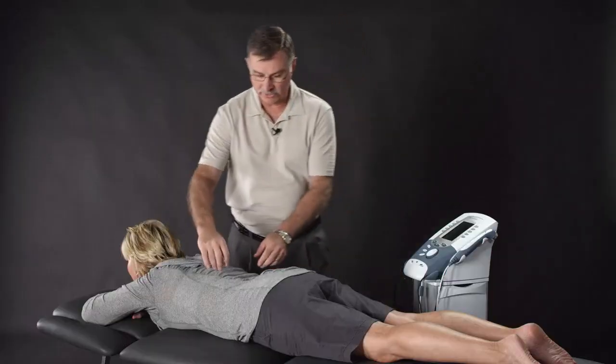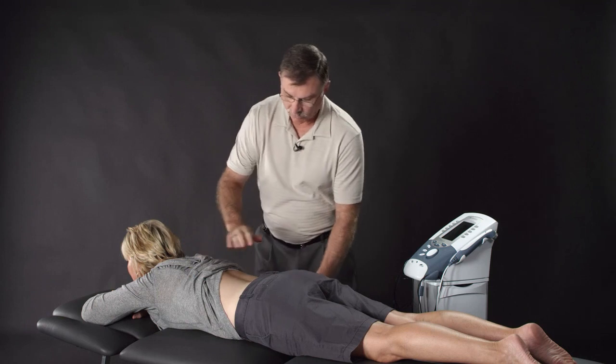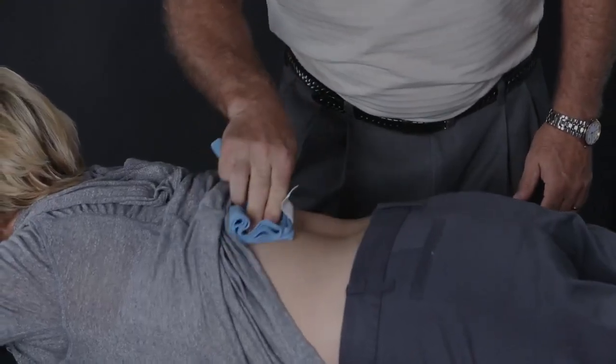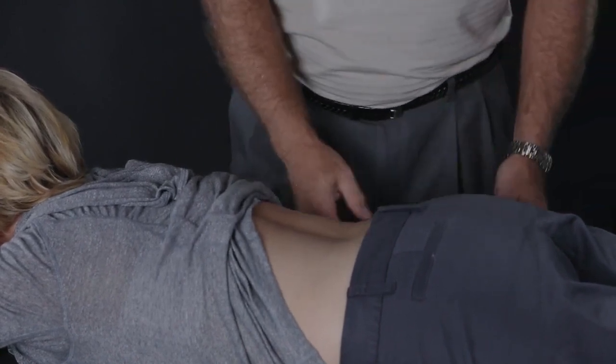Now, the first thing we'll need to do is prep the patient's skin. So we'll expose the back, we'll take a warm washcloth and we'll actually wipe the skin and prep the area to remove any excess oils or skin that's in the area.